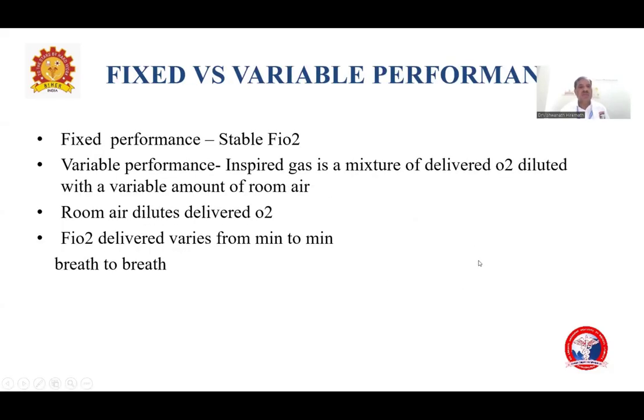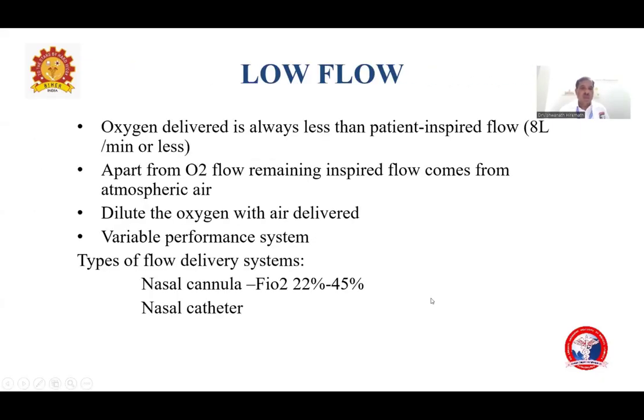Fixed performance versus variable performance. Fixed performance device provides stable FiO2. Variable performance: inspired gas is a mixture of delivered oxygen diluted with a variable amount of room air, which contains 21% oxygen. Room air dilutes the delivered oxygen, and FiO2 delivery varies from minute to minute and breath to breath. In low flow supplementation, oxygen delivered is always less than the patient's inspired flow.